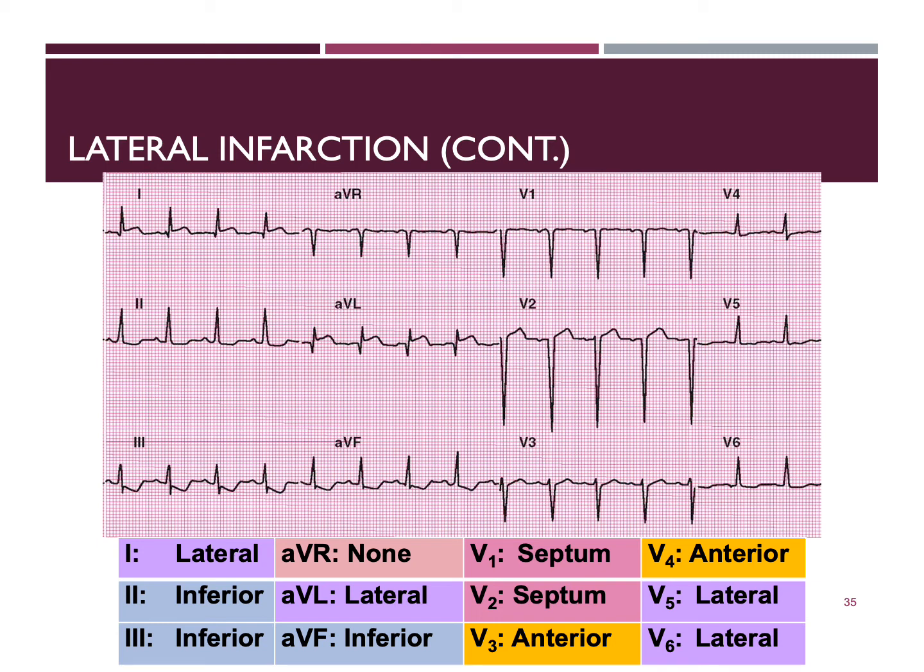The patient then had another episode of chest pain associated with the appearance of signs of acute lateral infarction, as shown in this tracing that appears on this slide. So what happened then was a repeat coronary arteriogram showed new blockage of the obtuse marginal branch of the circumflex artery.